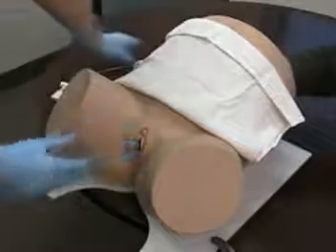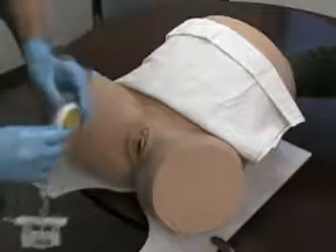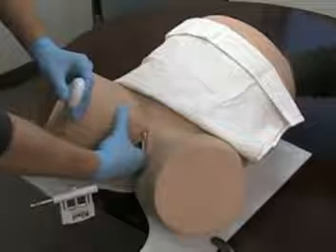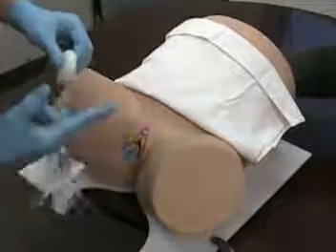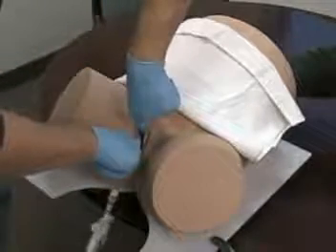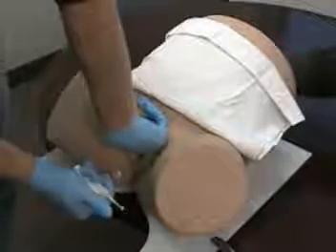The second step is to place the vacuum device over the flexion point. Recall, the flexion point is 3 centimeters forward of the posterior fontanelle. Thus, a measurement is taken from the posterior fontanelle 3 centimeters forward. The distance is determined, and the cup is placed at that distance. Two fingers are used to place the cup back over towards the flexion point, and then vacuum is obtained.